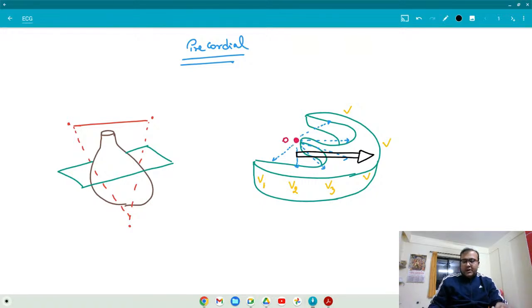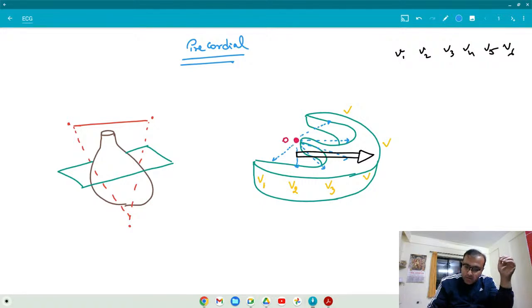Yes. So, tell me V1, V2, V3, V4, V5, and V6. You tell me V1. Are you looking at the tail of the train, or are you looking at the head of the train? Tail. So negative or positive? Negative. Very good. So it is a negative deflection.